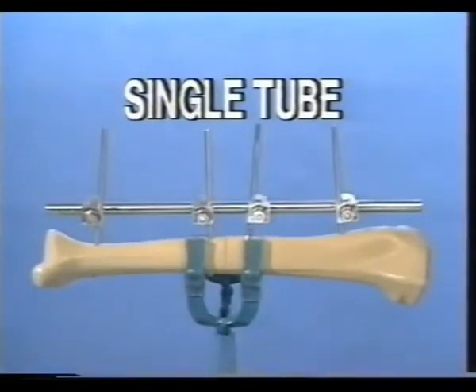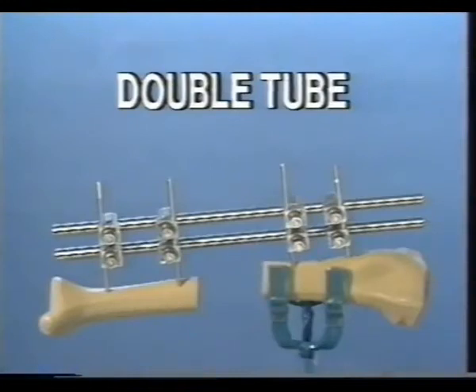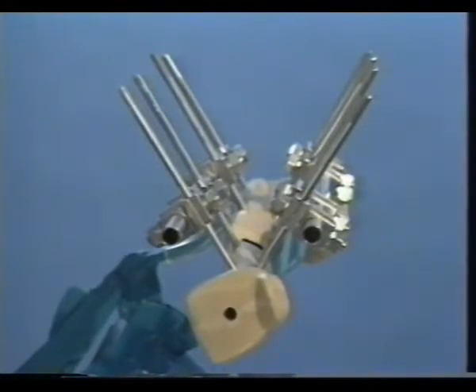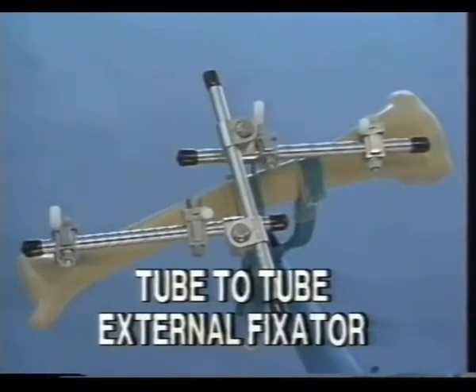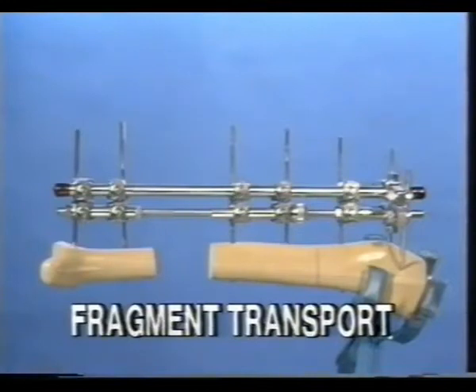The following standard configurations are presented: the unilateral sagittal fixator and its dynamization, the double tube unilateral fixator and its dynamization, the V-shaped unilateral fixator, secondary corrections with the tube-to-tube clamps and three short tubes, and the fixator for fragment transports.